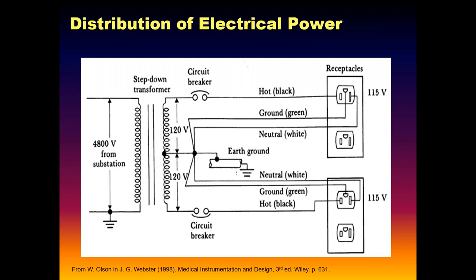It would be 40 watts just being dissipated in the wire. But of course, if that got too hot, then you bump the wire, you start fires, stuff like that. So we protect those circuits with the fuse. But the key thing, again, this is electric code, National Electric Code requirements. These are not up for debate. These are mandated by code.